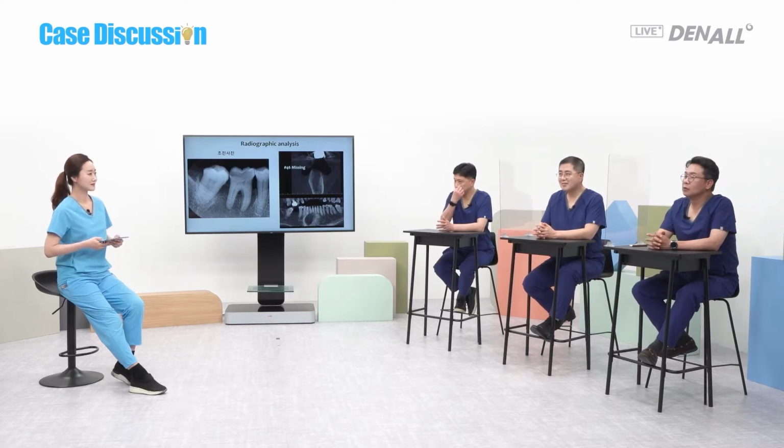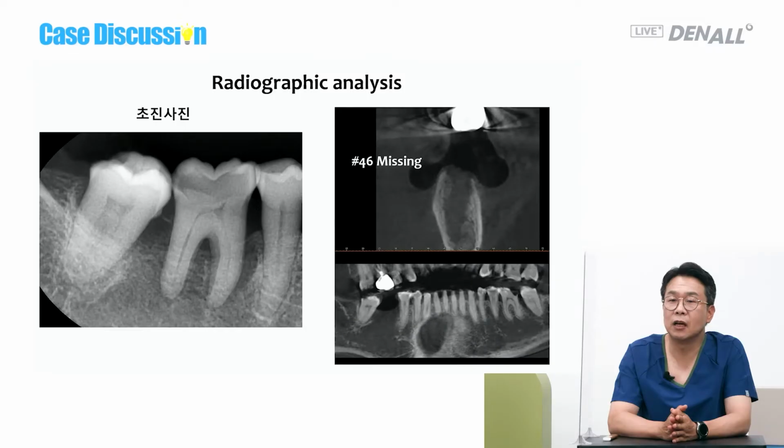This is a common case that I see clinically. If you look at the initial exam and the after-extraction image, it doesn't tell why it was extracted. The patient is a senior patient. That can occur due to perio disease and also from root planing. Therefore, when we do the extraction, we tend to be careful in doing curettage.